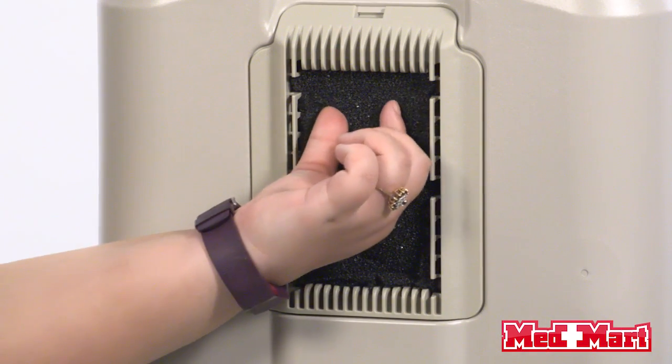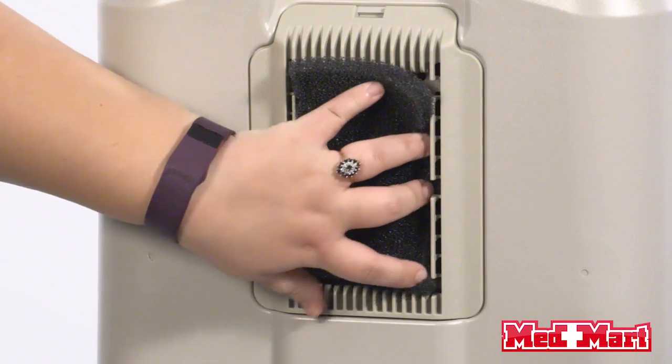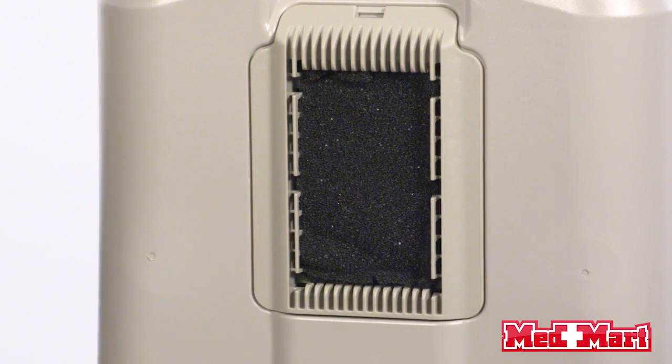Customers have said that it's very lightweight, it's easy to move around their home, and they like the fact that it's on wheels. This machine is very low maintenance. The only maintenance you'll have to do on a monthly basis is take this filter out of the back, run it under warm water, and let it dry. Once it dries, you're going to put it back in your machine. The only other maintenance needed is that it does have an internal filter that needs to be changed once a year.